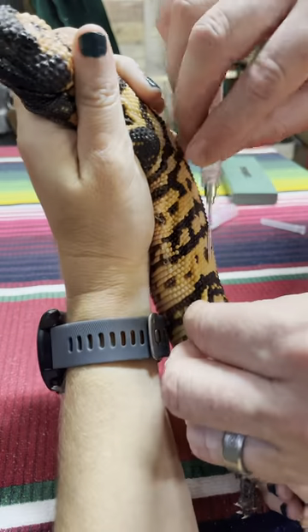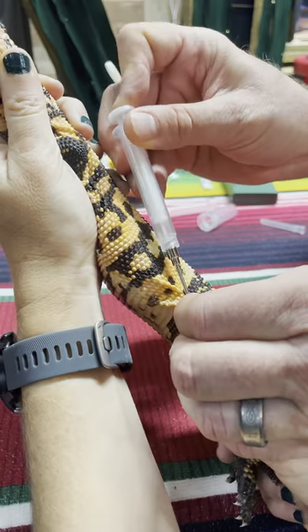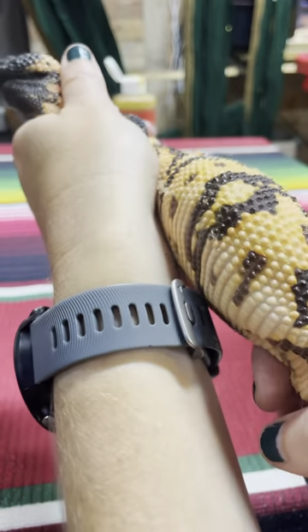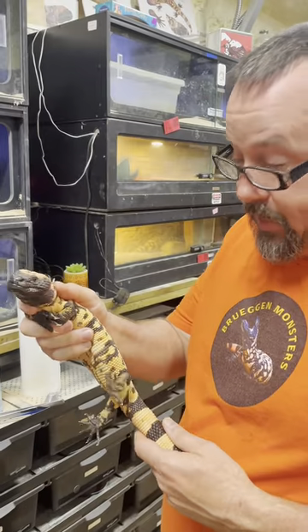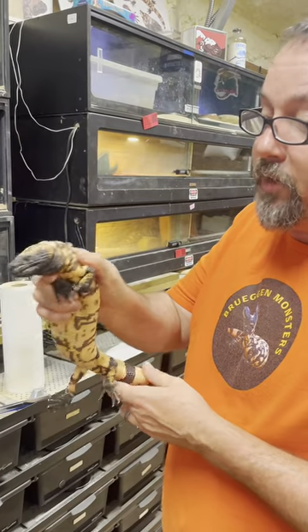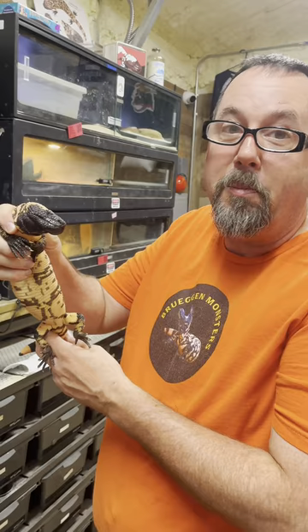You want to get right under the skin, so this thing just sits there. He actually seems more irritated when I touch him with the glue than with the needle. We just finished pit tagging seconds ago. He's very interested in food — it's feeding day — and he's not gonna miss a meal because we're messing with him like this.